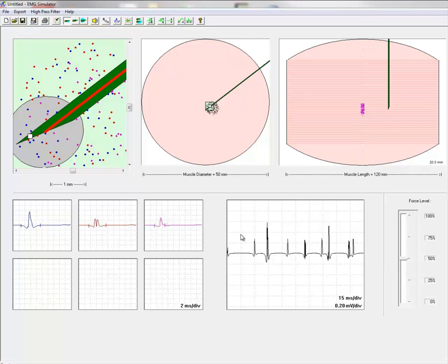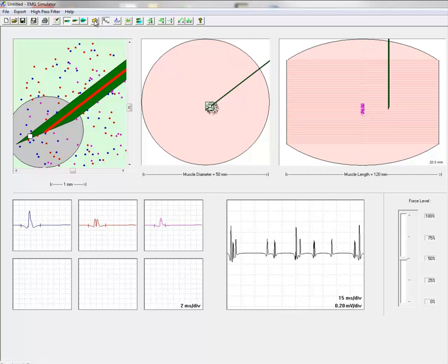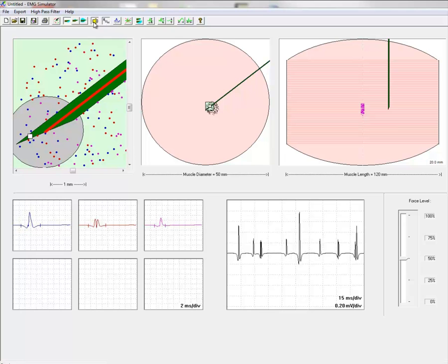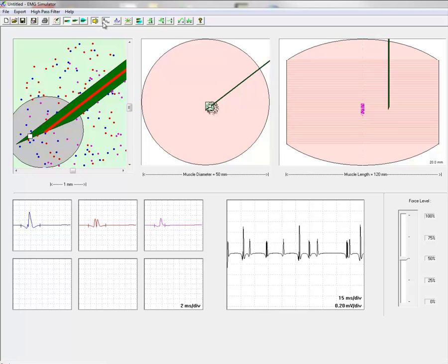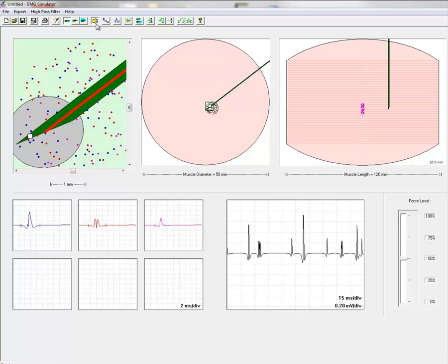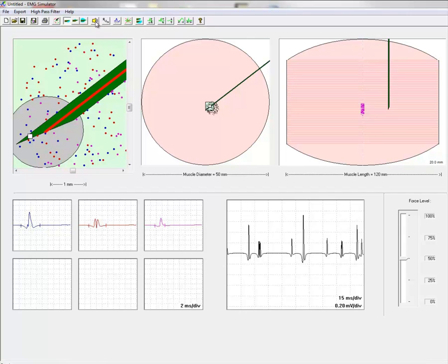Thus for a given recording position different motor unit potential shape indicates different motor units. But when an electrode is moved the motor unit shape cannot tell if the recording is obtained from the same or from a different motor unit. Now let's look at the recruitment.